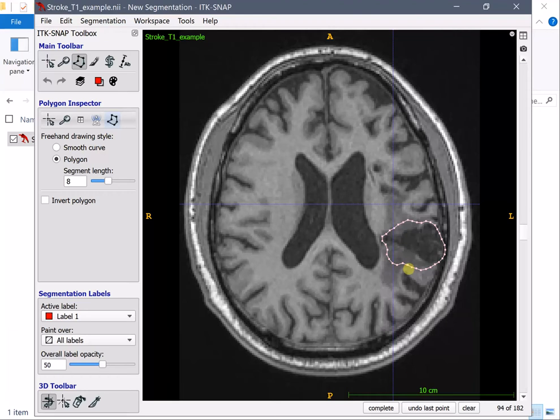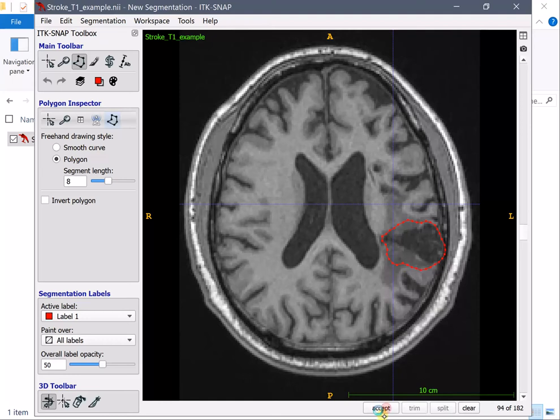Now once you have completed that slice you want to enclose the area of the lesion. If it didn't close by itself you can press down here complete and one more time accept and this is your slice.